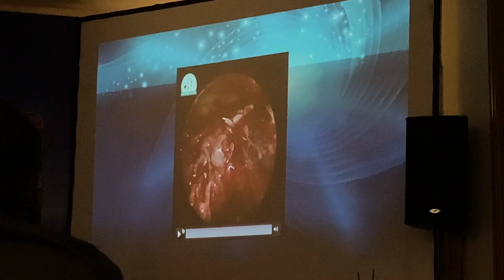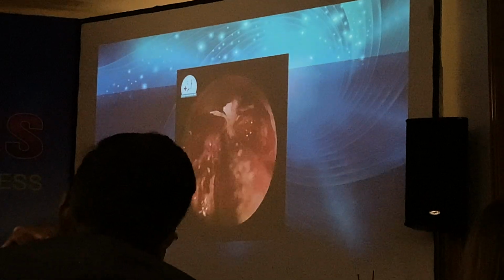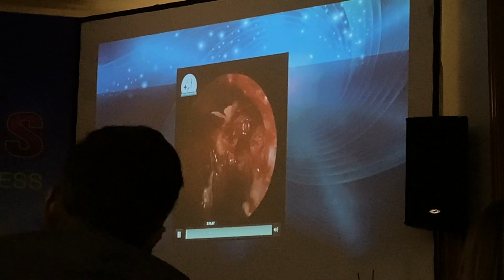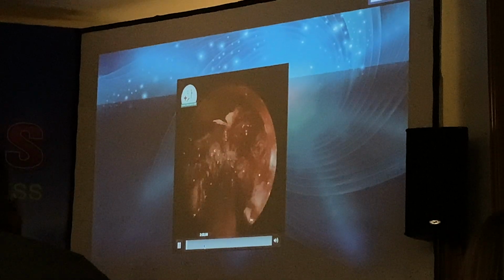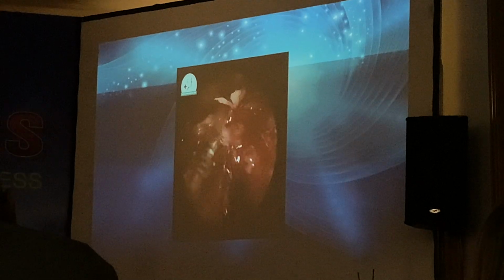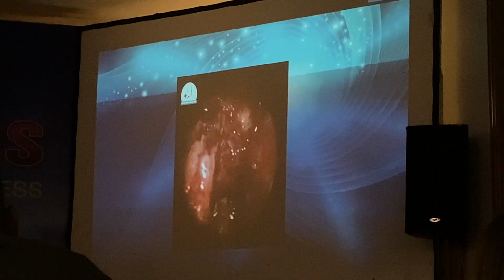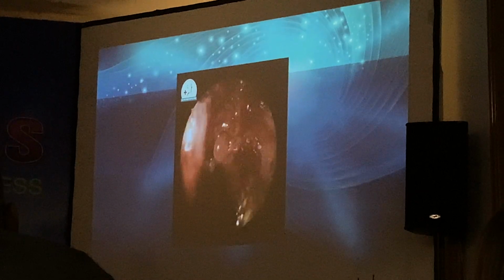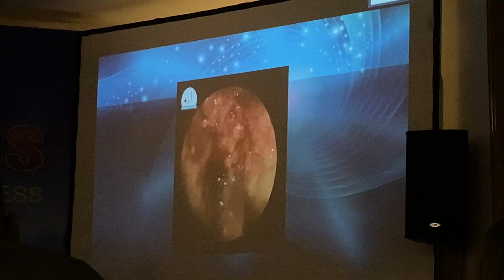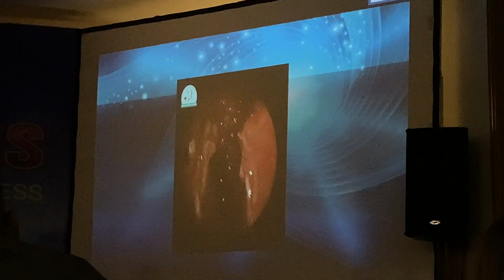This is after the flap free. You can see a lot of inverted papilloma. In this case, we still preserve the periorbita and just use a very low dose, low energy of the bipolar to clean the remnant of the papilloma at the periorbita.